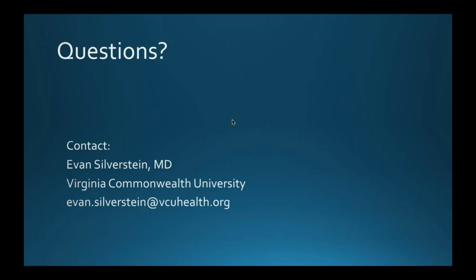Okay, wonderful, thank you. Brian, this is Mary Ellen. I would just add, in regards to this question about rescreening right away if the device times out, there's something with children called accommodation. These children have the ability to refocus, so you may get a different reading than you would the first time. So it's recommended that we go with the first reading that is taken, and if it times out, you should probably wait a good period of time before you rescreen that child, so that you can get a more accurate reading.